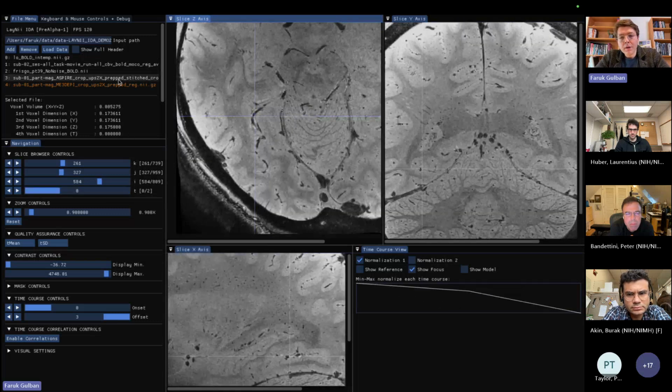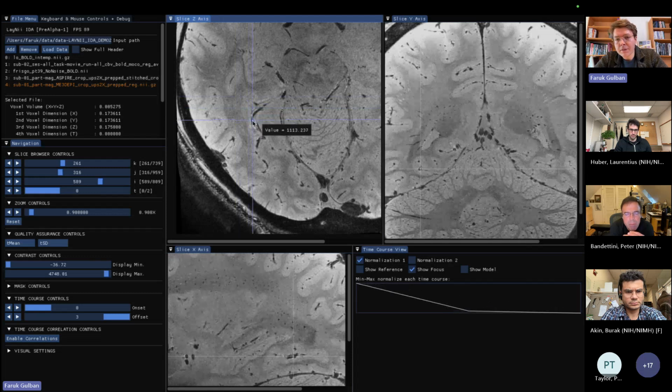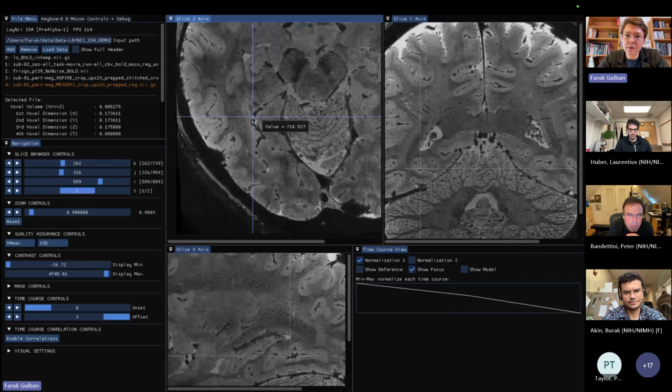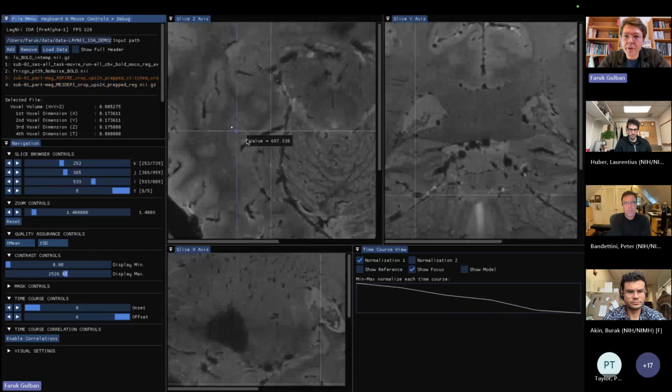The reason is the following. When you have a long readout duration, such as in fMRI data, and in this case the longer readout time 3D EPI anatomical data, this artifact gets smeared out of the image through the k-space sampling and image reconstruction, so you do not see a clear trace of it, as you would in GRE data like in here.